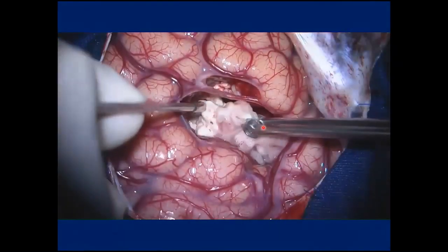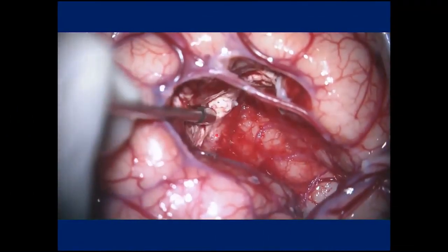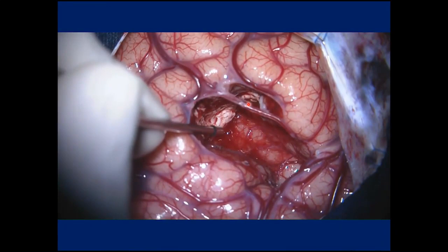Removing the whole cortical dysplasia. You can see this is the superior limiting sulcus of the insula, and that is the place where I should stop. So this is a total resection, the final aspect, maintaining intact the cortical branch of the MCA, and here we have the insula and the superior limiting sulcus of the insula.